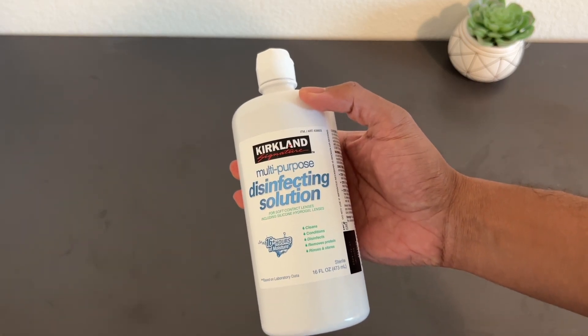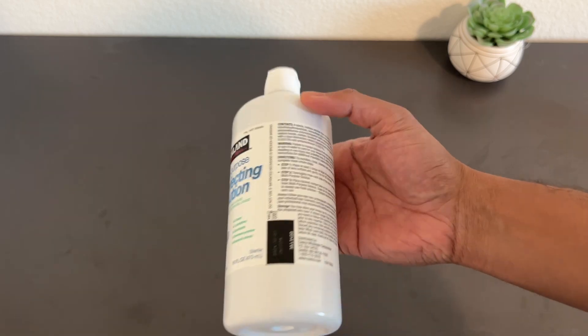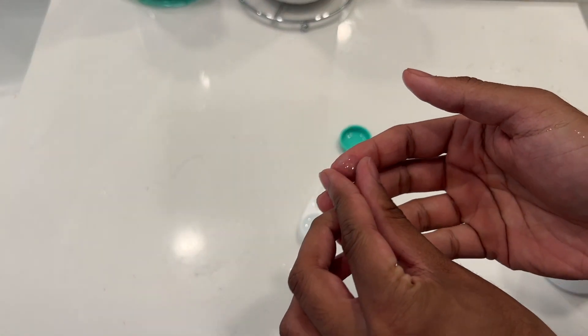Here's the Kirkland contact lens solution. It cleans and disinfects your contact lens, and it also comes with an extra lens case.